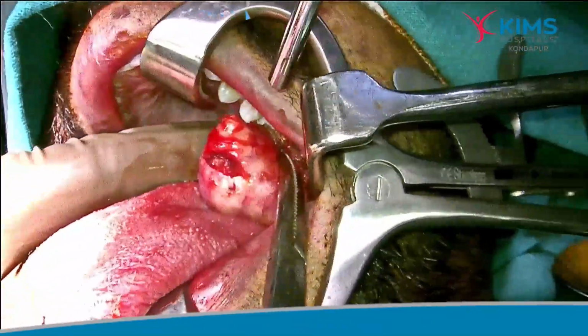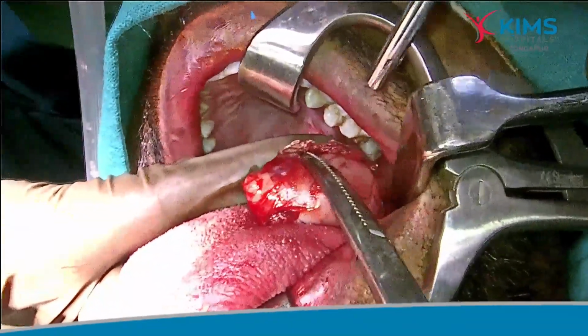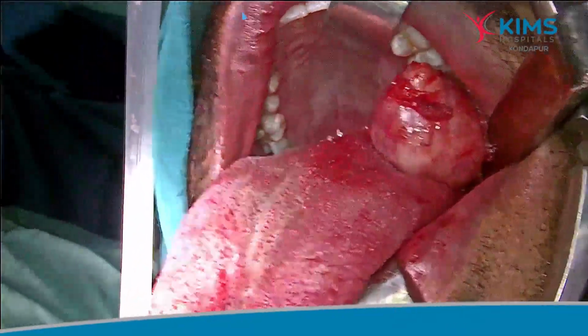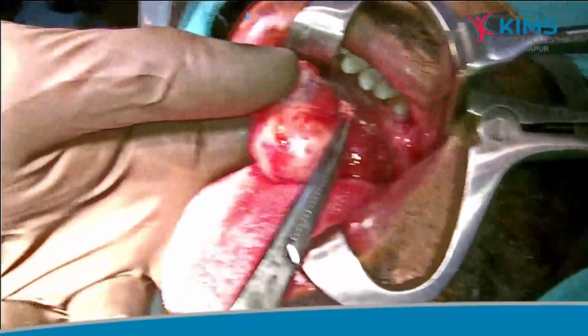Further dissection continued along the plane of dissection. Hemostasis secured well. It is under control. The tumor is separated from the base completely, and now the superficial part is dissected further.